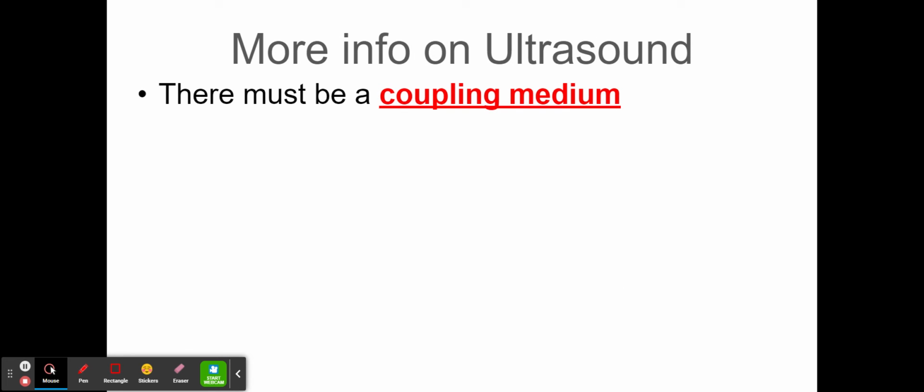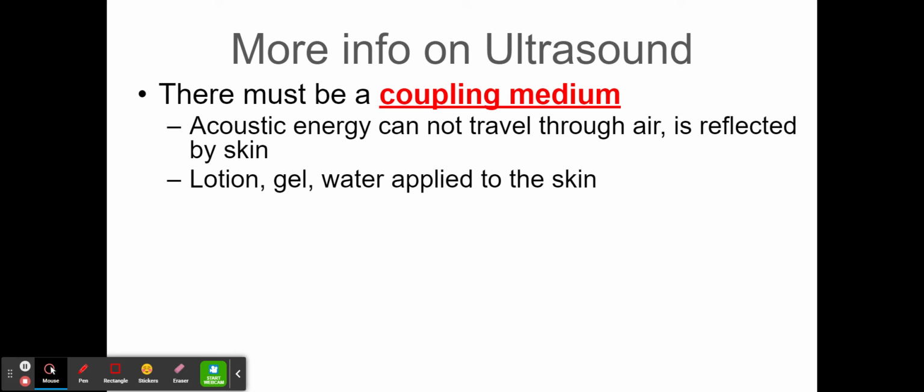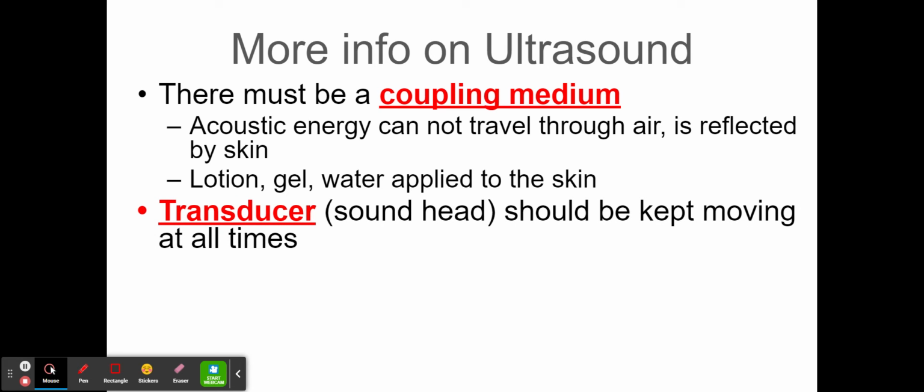Okay. There must be a coupling medium. What that means is there has to be some sort of gel. Ultrasound only works with a gel that's applied to it. It cannot travel through the air, and it is reflected by the skin. So you have to have something to go through. Lotions, gel, some type of water applied to the skin will help drive that through the skin.